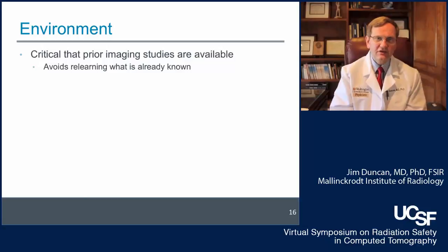I'd like to emphasize the importance of environment, particularly having prior imaging available when you're doing a procedure, because that can help you avoid relearning what is already known about your particular patient during the fluoroscopic segment.